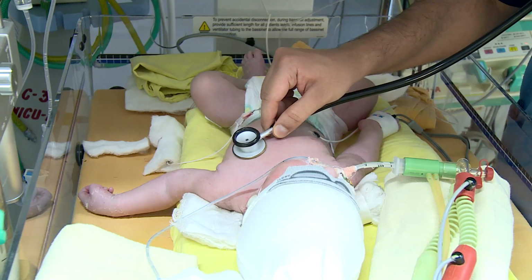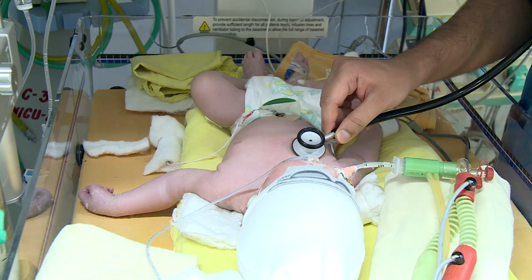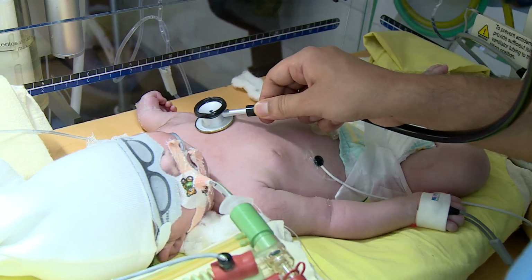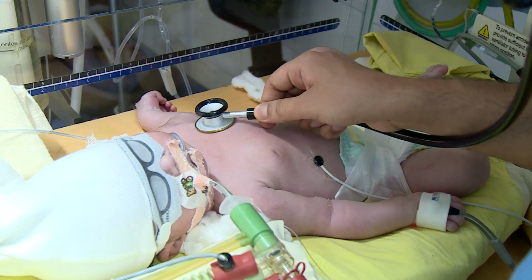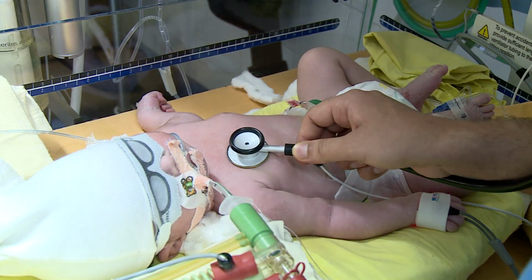Listen to the breath sounds in infants ventilated on HFO ventilation. The sounds, which are friction sounds, may become reduced in the affected side when the ET tube is low and ventilates only one lung, or when pneumothorax is present.